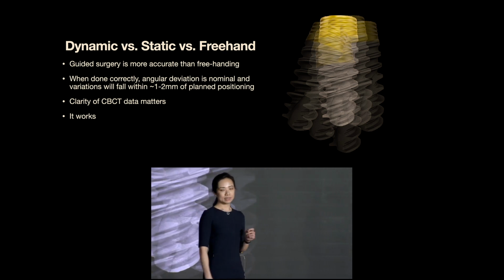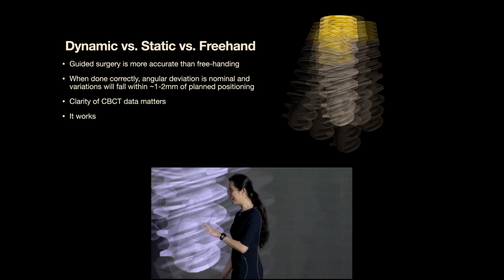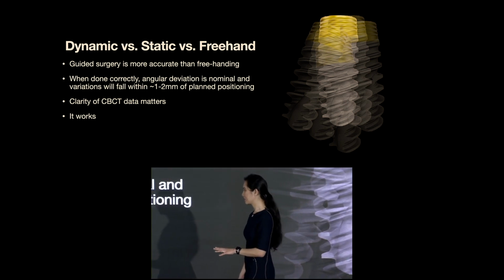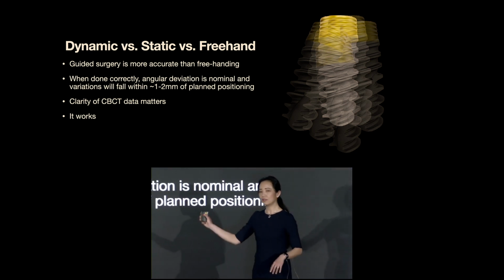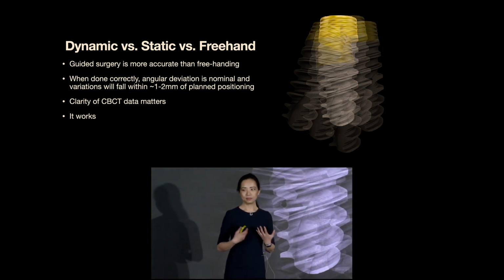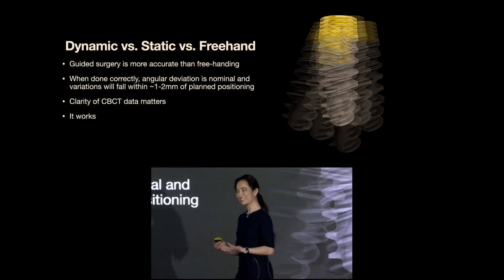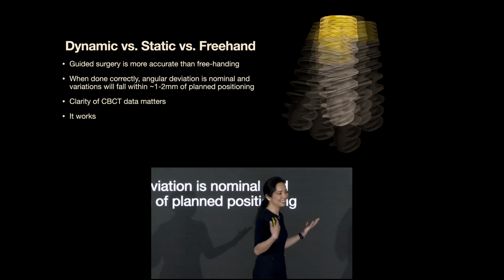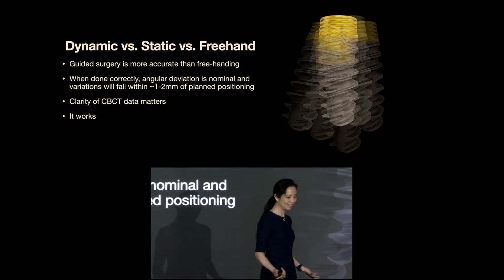Clarity of the CBCT seriously matters when it comes to planning a dynamic surgery. And lastly, most of all, it works. So for some surgeons, it helps them do a better job at being a surgeon. And for those who are freehanding well, I'm not here to tell you that you need to convert, because obviously you're having a great time.